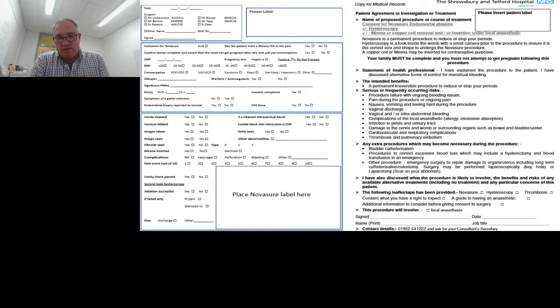follow-up or not. We don't routinely follow any of our NovaSures up now. We discharge them all. And then to the right of the screen is our standardized pre-printed consent form, which we'll use for patients. And again, it speeds up the whole clinic process and standardizes everything.